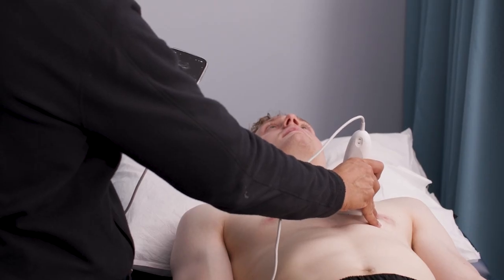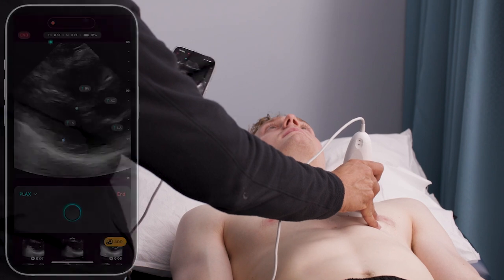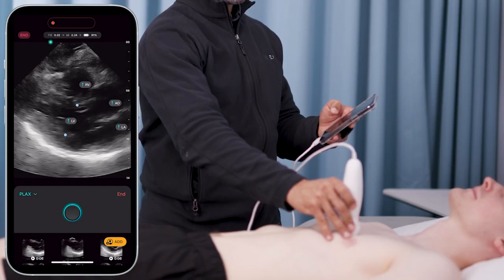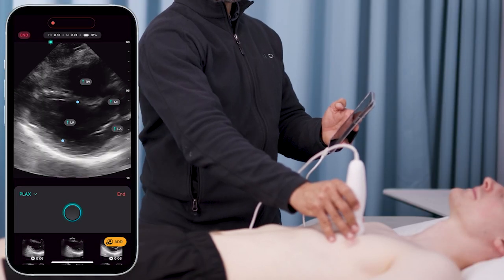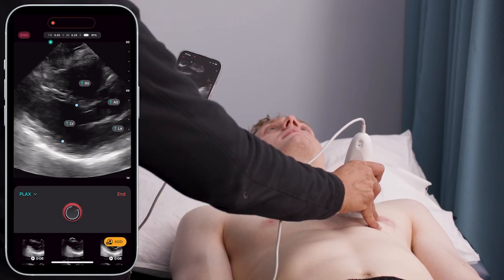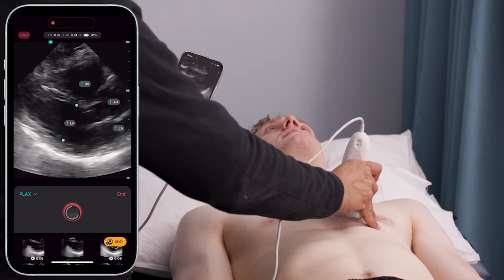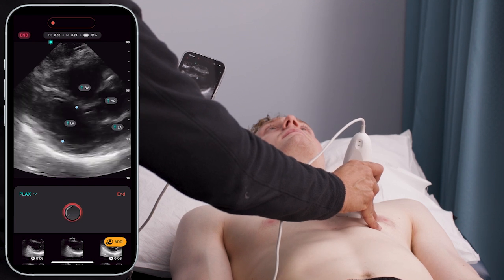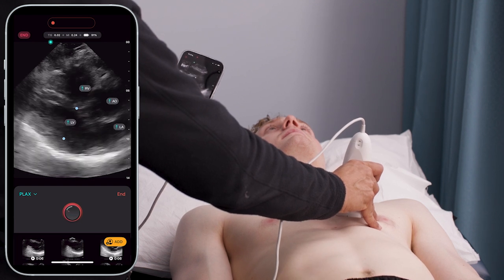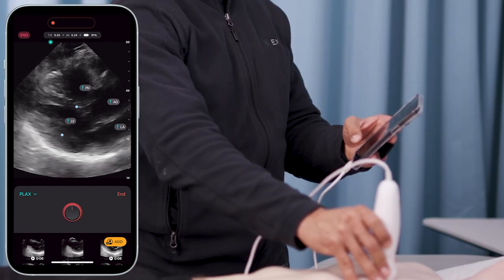Right away, when I turn on the AI in PlaxView, it begins analyzing the image. Once I have a good view, I click a button, and the AI calculates left ventricular ejection fraction and stroke volume.